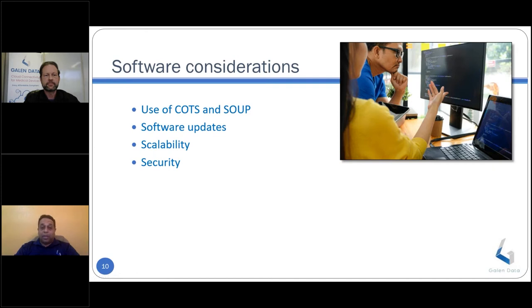So it's very common to use open source software, specifically free open source software, as a building block in software development. I do it, we do it, everybody does it. But for compliance and security purposes, we need to understand what that means, right? So problem mitigation, because this software can contribute to your risks, to the patient or to your device in general. So problem mitigation must be put in play.